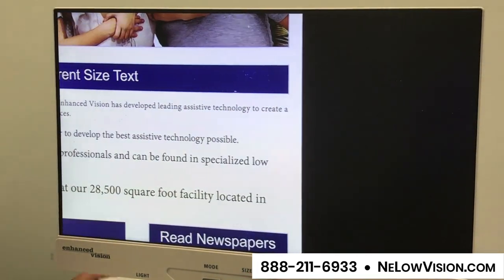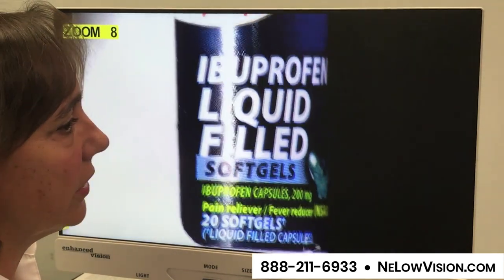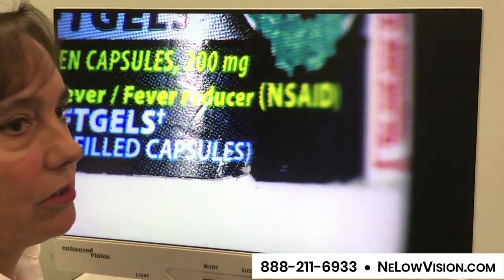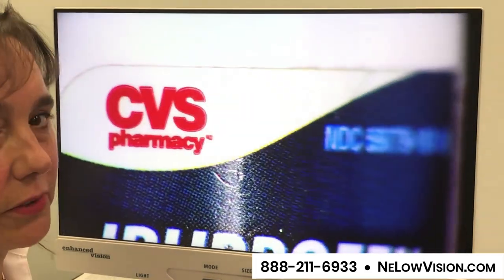I also wanted to show you some of the other tasks we've got going at home — sometimes prescription bottles or medication. You want to be able to see clearly what it is that you're taking and any additional information you may need to know. Imagine an expiration date, refill information, phone numbers if you want to call and get that refill taken care of.